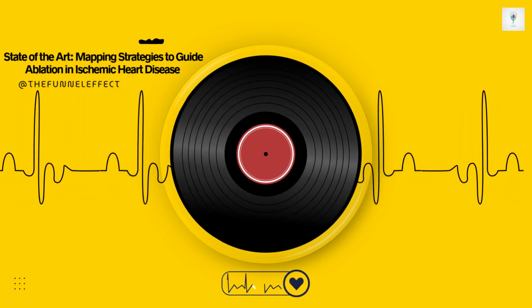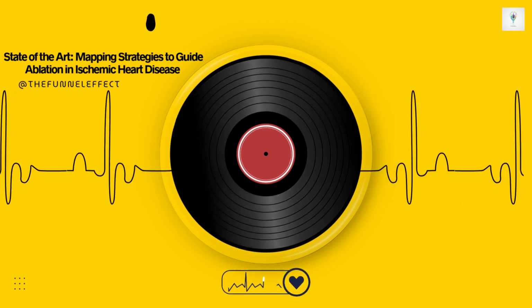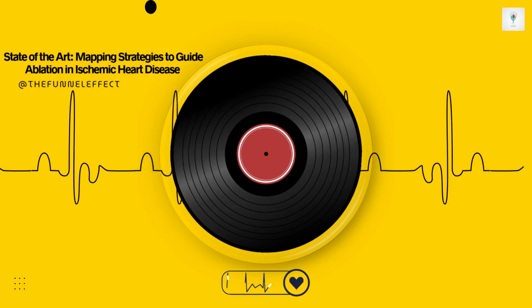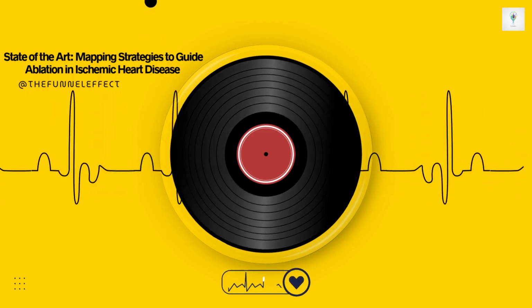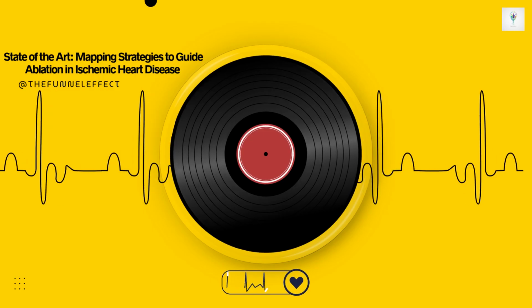It really is. The review stresses this constantly. The 3D nature of the scar is a huge challenge. If that critical isthmus pathway is buried deep within the heart wall, what we call an intramural component, our mapping catheter sitting on the inner surface, the endocardium, might be electrically quite far away. So you might not even see it properly from the surface.